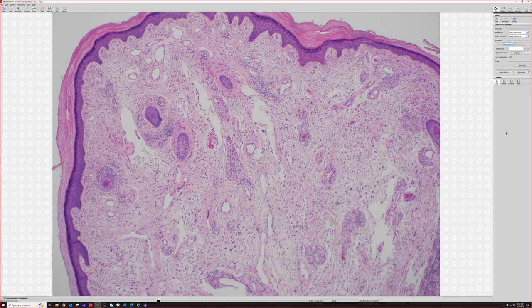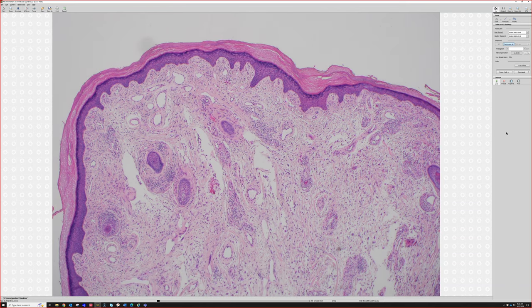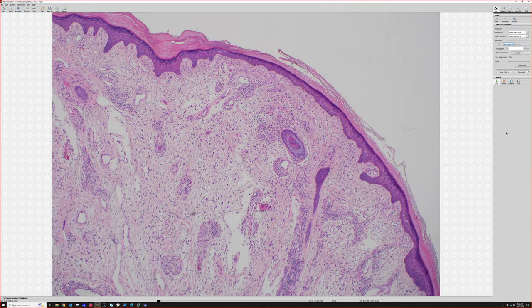And you can have scattered pleomorphism in them. You can have myxoid change. You can have epidermal induction that has basaloid follicular appearance. You can have really dilated vessels. You can have really sclerotic stroma and all of that. So anyway, just know that that's a nice take-home pearl, that if you're like, I think this is on the nose and it's a spindly thing with some vessels, the answer is angiofibroma until proven otherwise. Cool? In real life, again, we do have to think of other stuff.